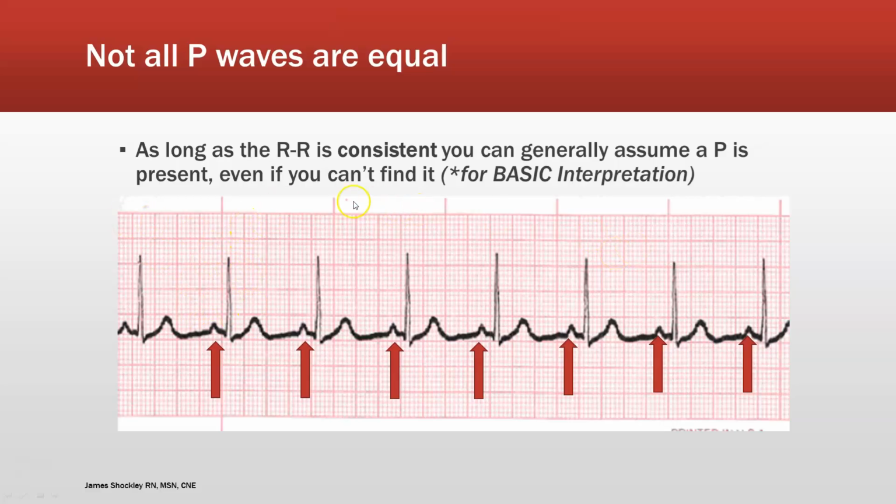For just basic nursing, what we're going to look at when considering if this is an atrial or a ventricular dysrhythmia is the presence of the P wave. Sometimes, though, that P wave can be hard to distinguish. So for the rhythms that we're going to talk about, if that QRS complex is skinny, then it's probably in the atria.